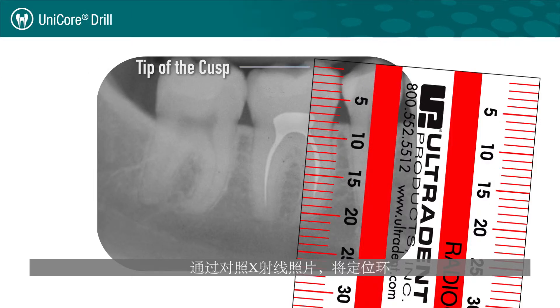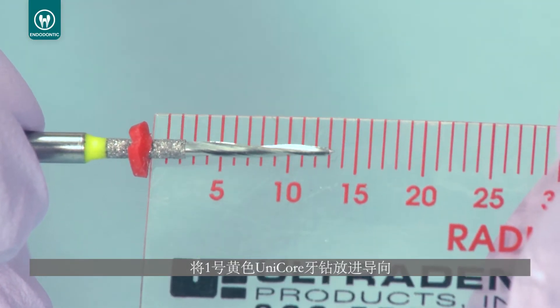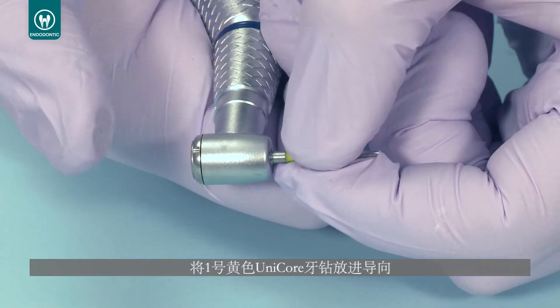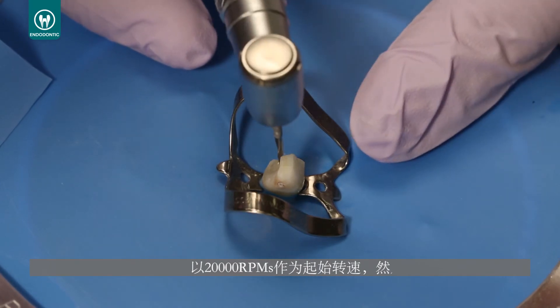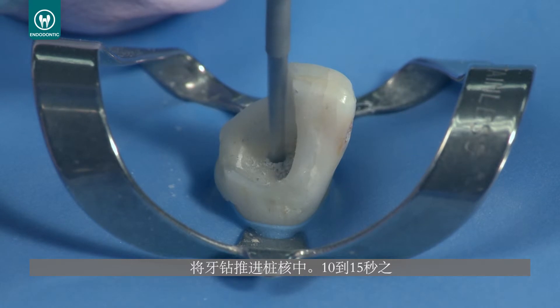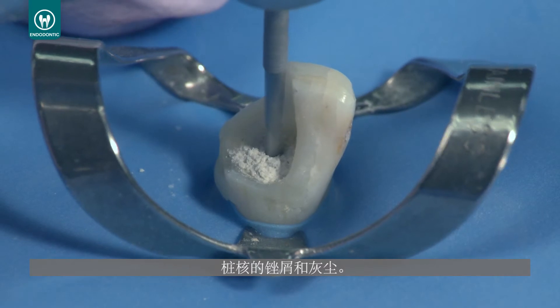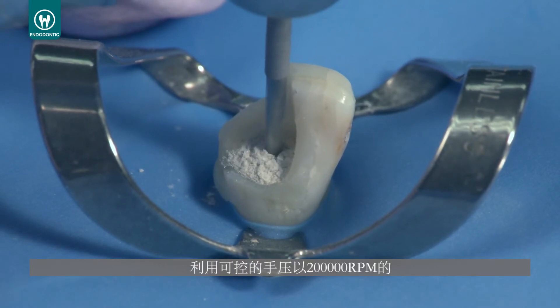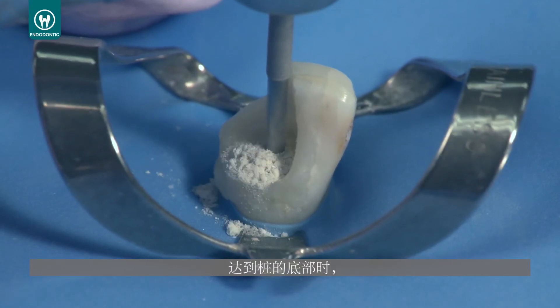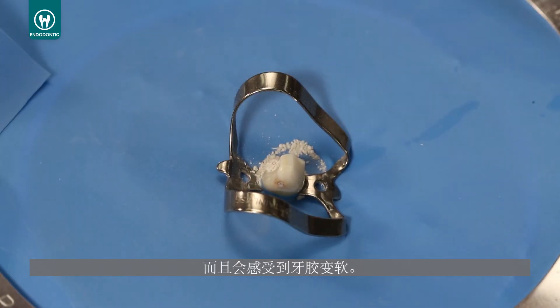Place the rubber stops on all Unicore drills at the appropriate length of the existing post by comparing them to the x-ray. Place the number one yellow Unicore drill into the pilot hole. Begin rotation at 20,000 RPMs and begin pushing the drill into the post. After 10 to 15 seconds, the heat generating tip of the drill should begin to create fillings and dust from the post. Continue to follow the post with controlled hand pressure at the full 20,000 RPM speed. When you reach the end of the post, the drill will punch through into the gutta percha and it will feel softer.